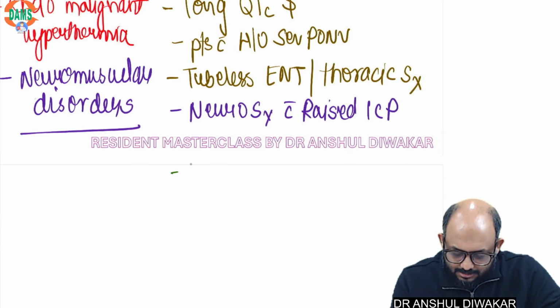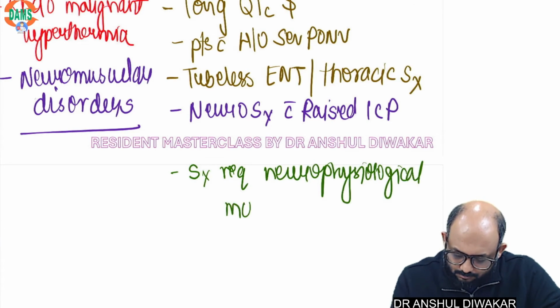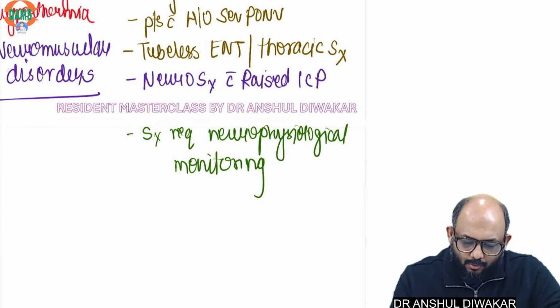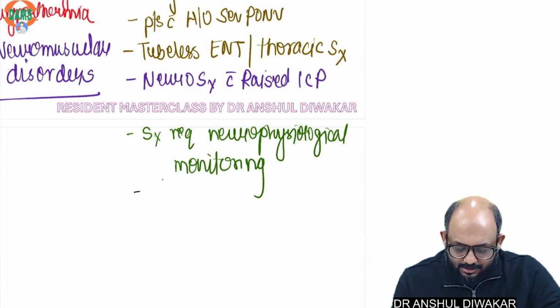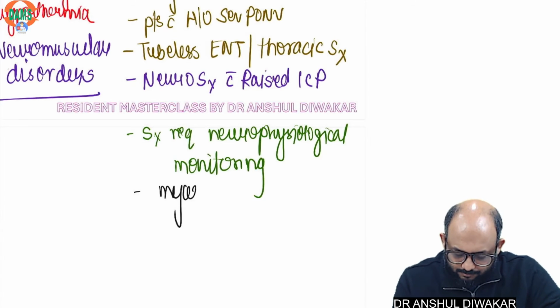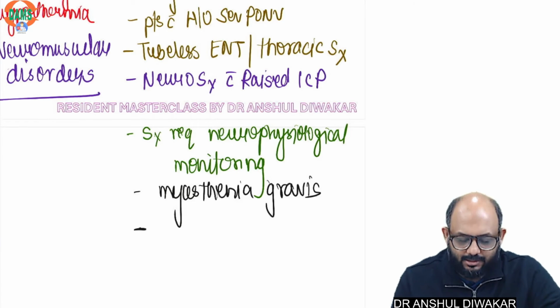Then surgeries requiring neurophysiological monitoring, then myasthenia gravis, or patients where you have neuromuscular disorders, which we have already seen.